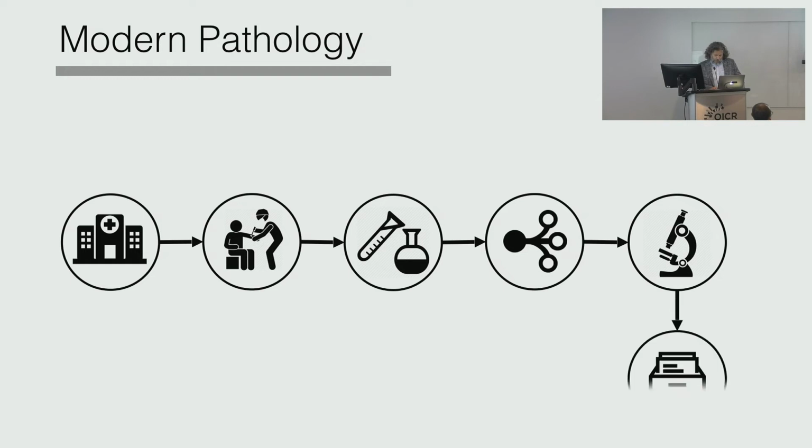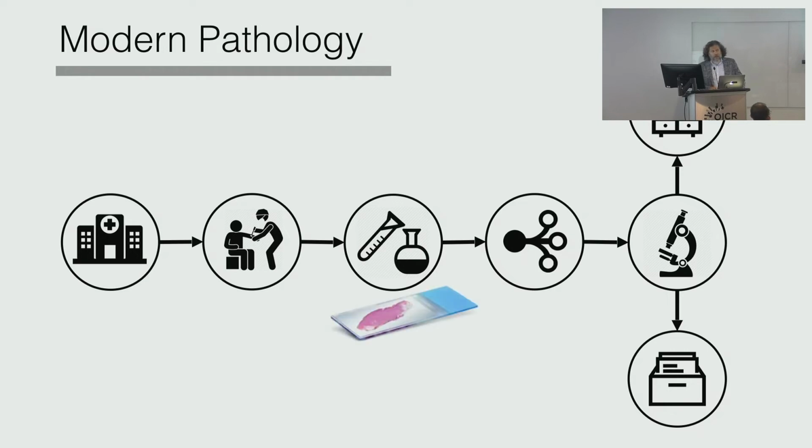And when the pathologist is done, he or she writes a report and files the report somewhere in the information system of the hospital and sends back the glass slides to the archive. And that piece of glass slide is everything. Another major difference between pathology and radiology is that in radiology, you go in, you stay in front of the machine, and an image is taken. Not many of you, I'm guessing, remember the films.